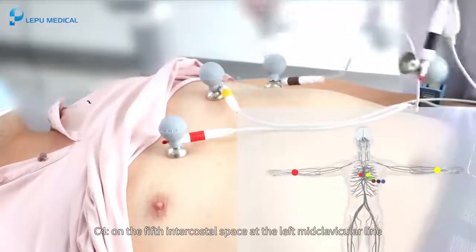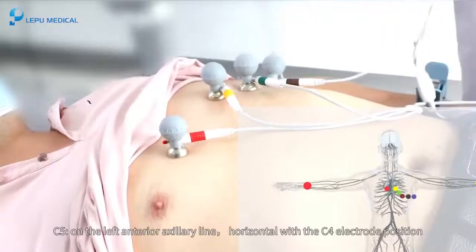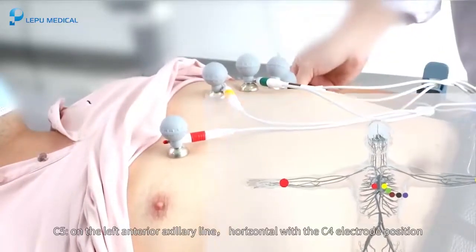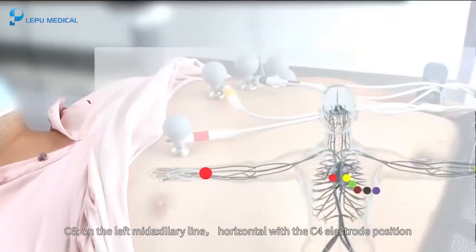C4, on the 5th intercostal space at the left midclavicular line. C5, on the left anterior axillary line, horizontal with the C4 electrode position. C6, on the left midaxillary line, horizontal with the C4 electrode position.